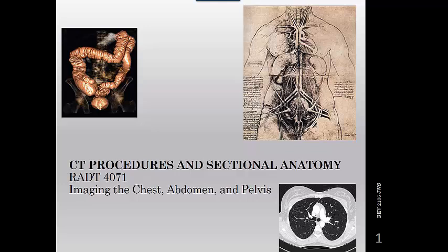Most thoracic protocols are performed while the patient lies in supine position on a scan table with the arms elevated above the head. Using the shortest possible scan time helps reduce the artifacts created by respiratory motion. And whenever possible, scans of the chest should be acquired within a single breath hold to prevent misregistration caused by uneven breathing between the scans.